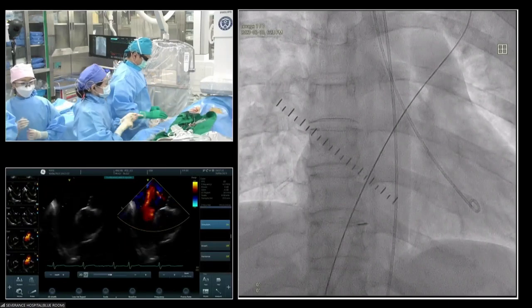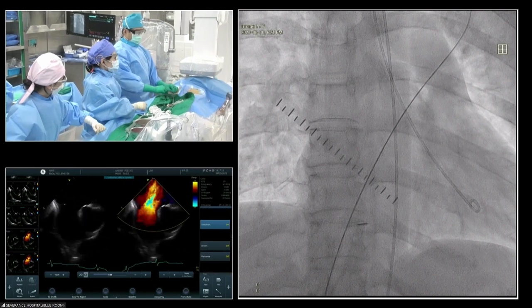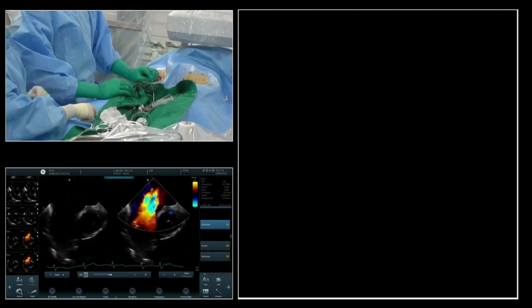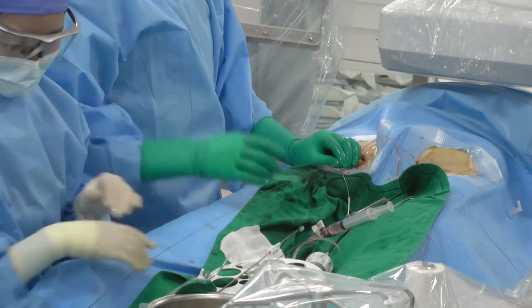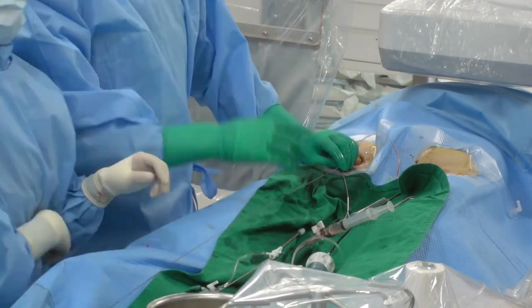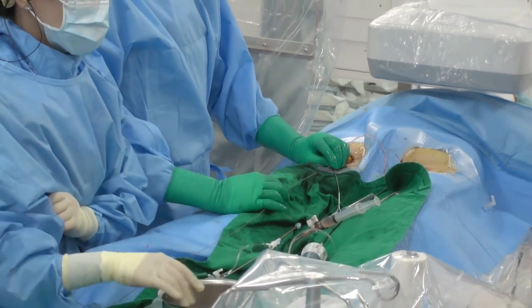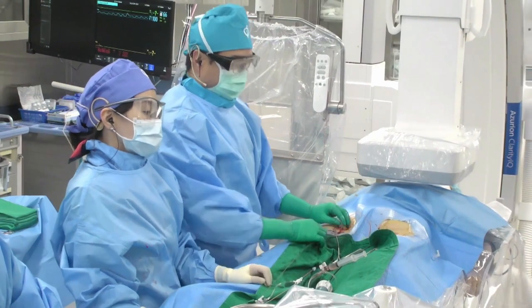The other Peter would do another thing. They would put the patient on diuretics. Of course, that is very important. Diuretics and ACE inhibitors, yeah. I'll measure the pressure after device placement, and if it is acceptable, then I'm gonna close this defect with this device and then use the diuretics and ACE inhibitors. One thing is that this patient is normotensive, no hypertension, but because the patient is very nervous now, the patient has a very high blood pressure. So that's possibly one of the reasons for the more exaggerated LV restriction.